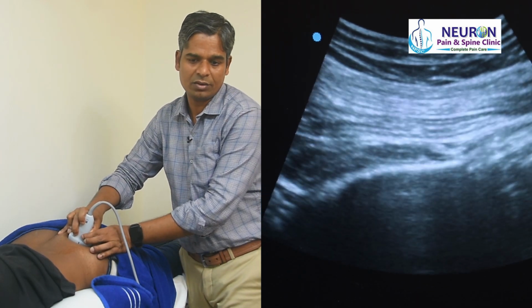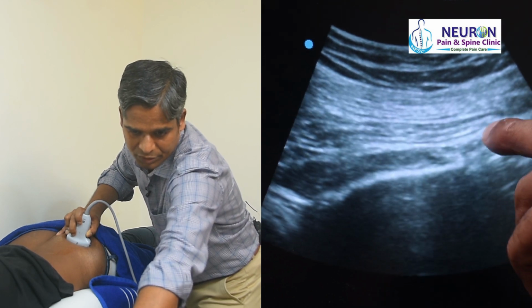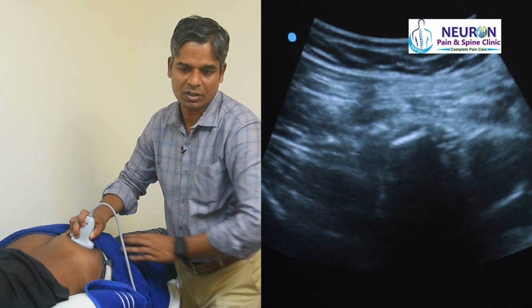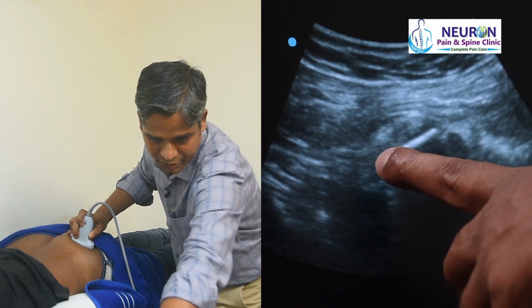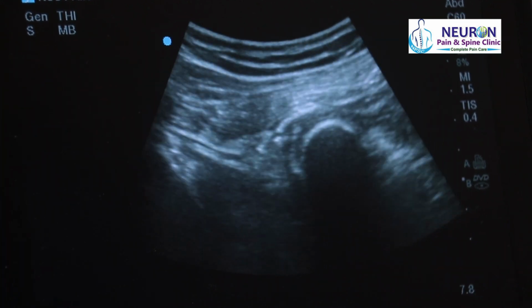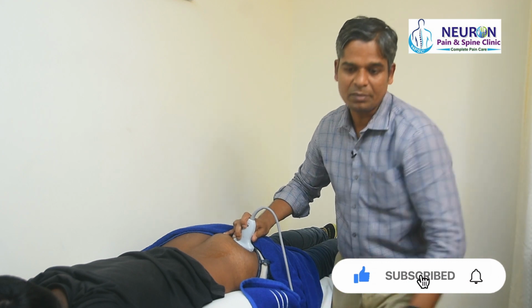That is for the pudendal nerve, just medial to the artery, where you do the pudendal nerve block between the sacrotuberous and sacrospinous ligaments. Then go down, that is for obturator internus. Here at the top, if you want to do a Botox for obturator internus, go down further, that is for your quadratus femoris for ischiofemoral impingement.